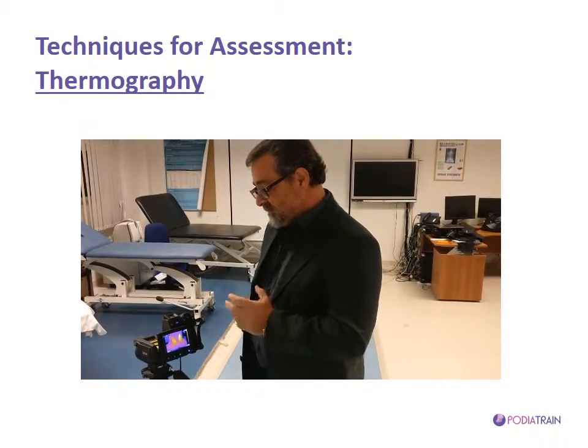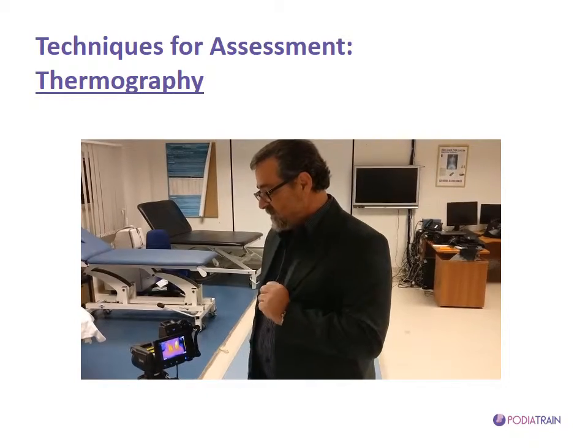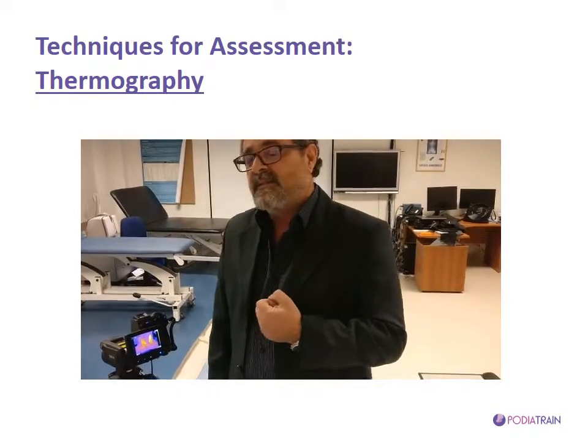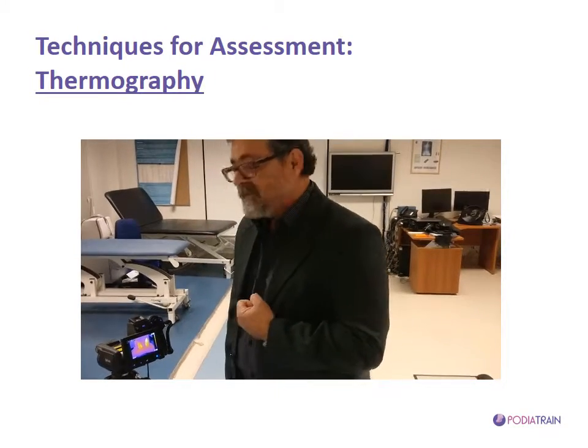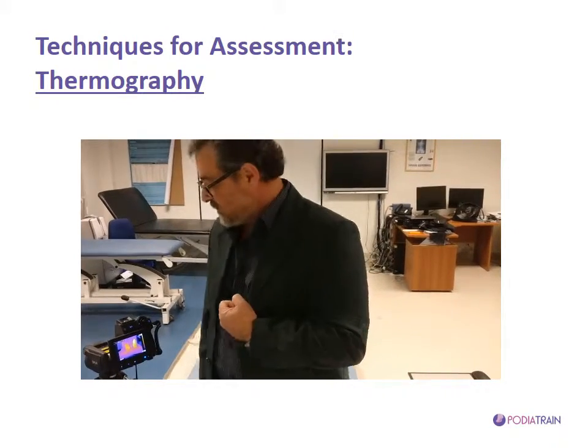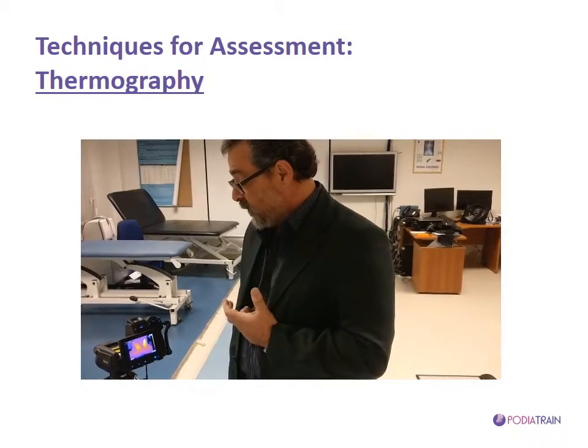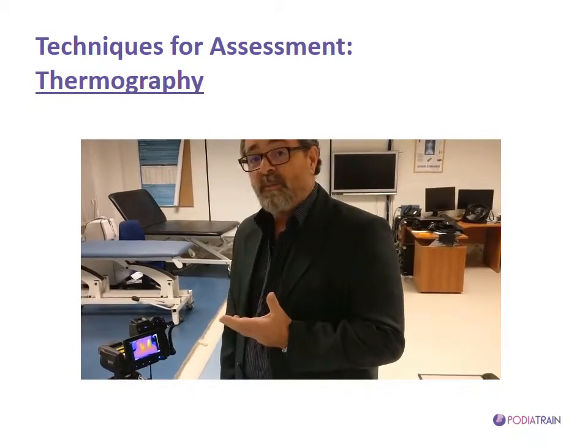In this case, this technology is so sensitive that even the minutest change in temperature is detected by this camera.